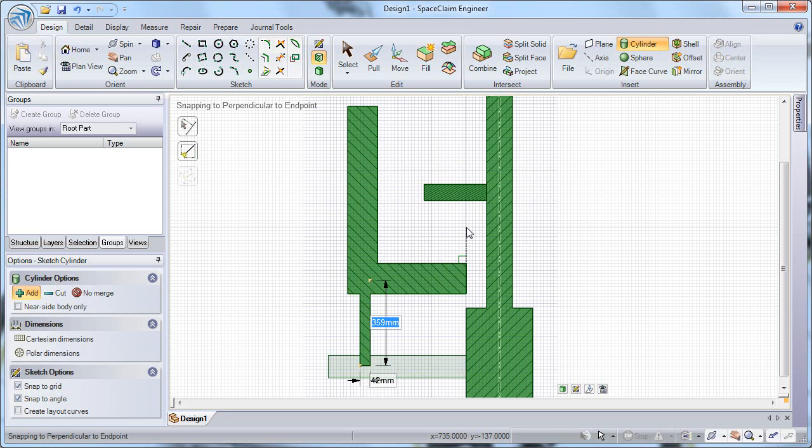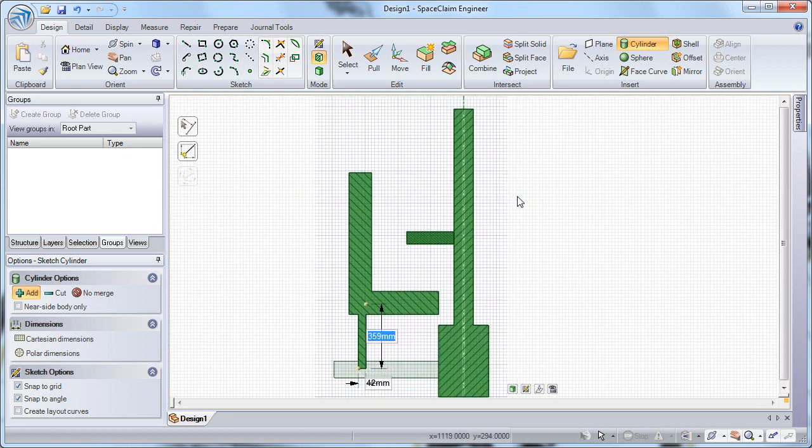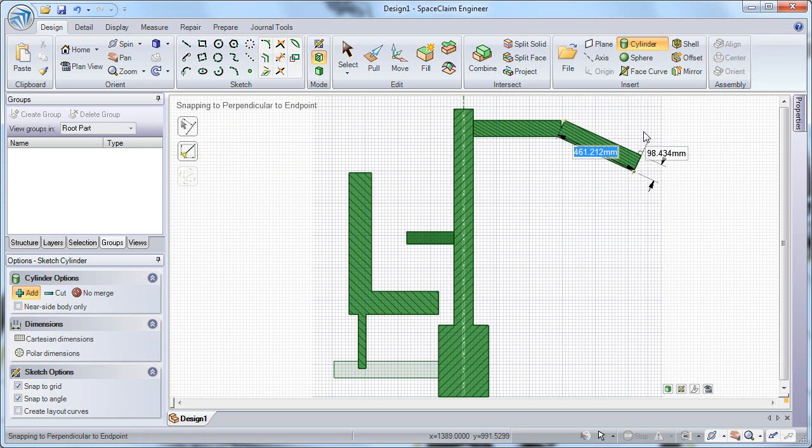Then I'll sketch a couple more cylinders at the top of my medical cart assembly representing the arm. I'll come off the other side, sketch a quick rectangle, quick cylinder, and then snapping to the center of that cylinder, we'll sketch a second cylinder coming off at an angle from that. Finally, I'll sketch a sphere to create geometry to fill in the gap between those two cylinders.